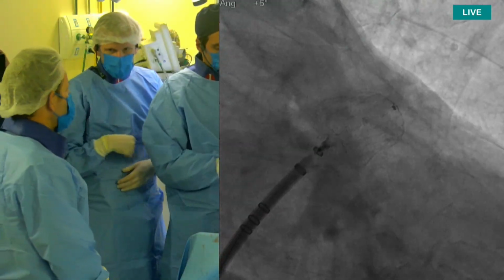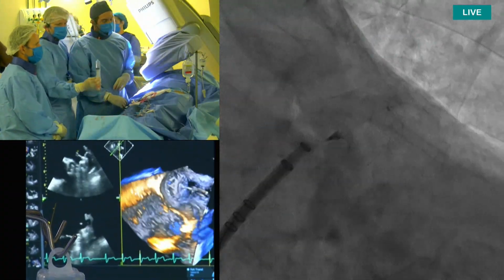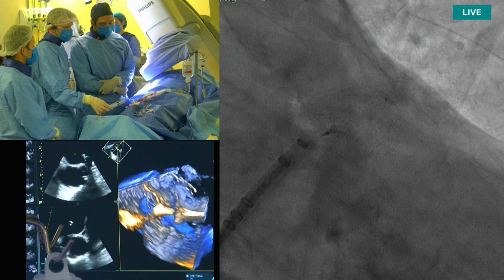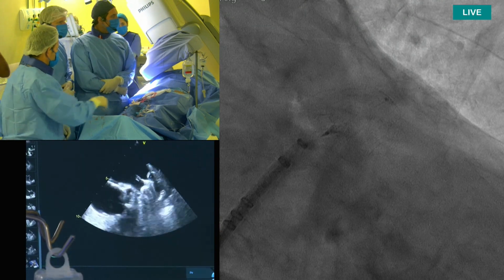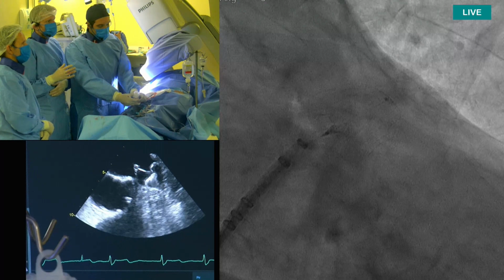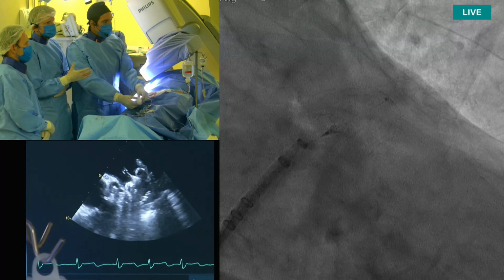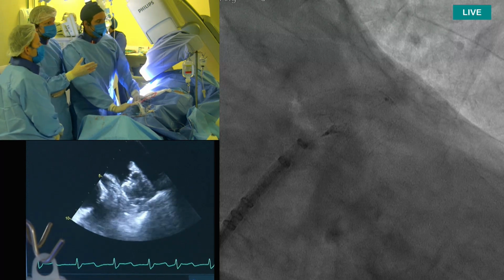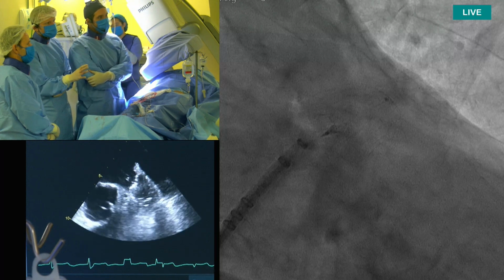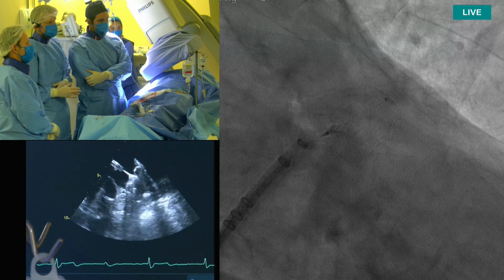Okay, I think this is looking excellent, I would say. I think it's good for educational value to repeat that, so people really see what the final position is. If you agree. Yes. But maybe let's focus a little bit on echo still. Is there anything we still have to screen on the echo? What I personally look at, we're sitting almost 100% to 90% distal of the circumflex artery, which is nice. We can cover all the trabeculations. The device is nicely coaxial with the central axis of the LAA, which I also like.